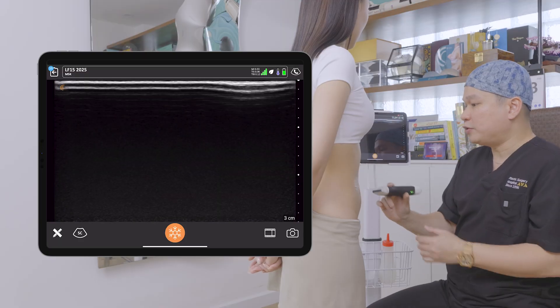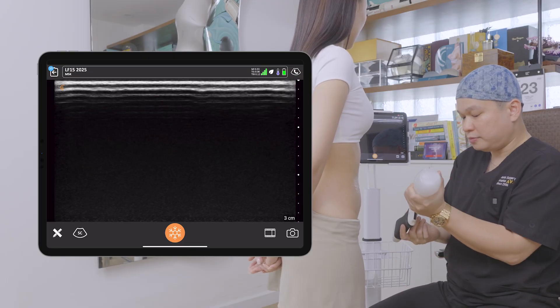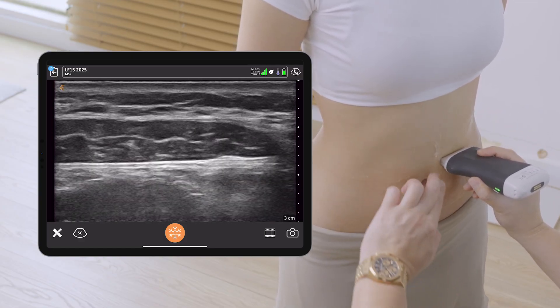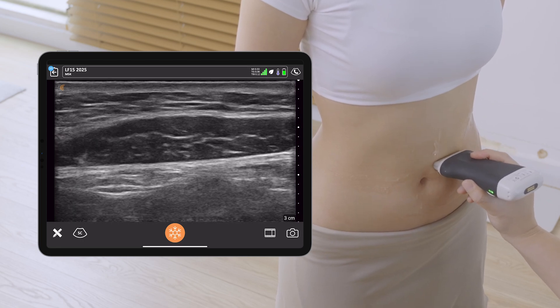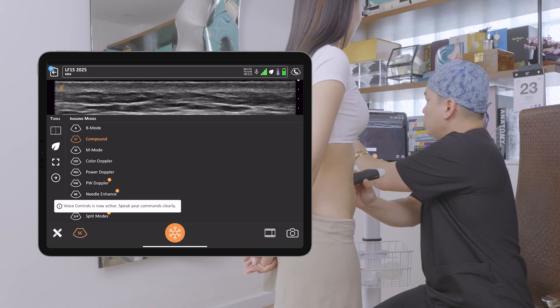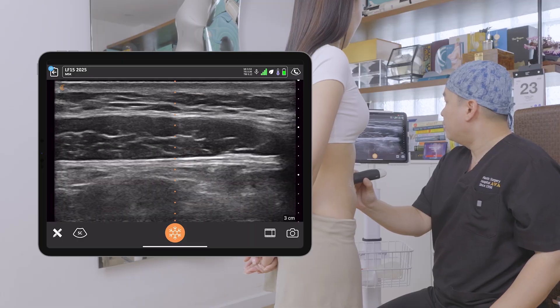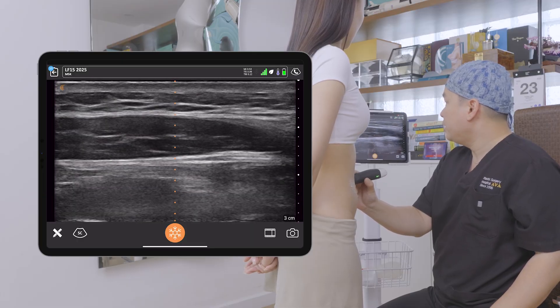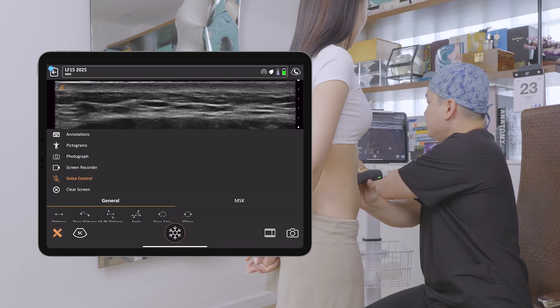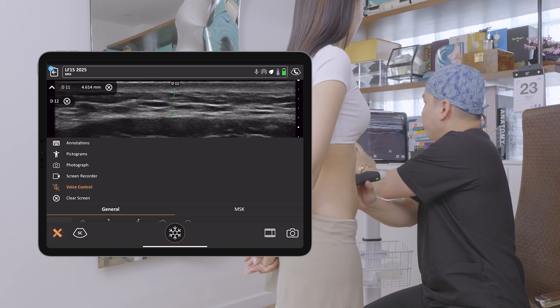Now I'm going to go into a detailed scan of the abdominal wall. I start my detailed scan with the left rectus, which is on my right side. I go from top to bottom, and at the level of about 3cm above the umbilicus, I will make my measurement. With the Clarius, you can turn on voice control to aid with measuring. So this is 3cm above the level of the umbilicus on the left side of the patient. I say 'freeze' and then I can start the measurement of the subcutaneous tissues and the thickness of the rectus muscle.